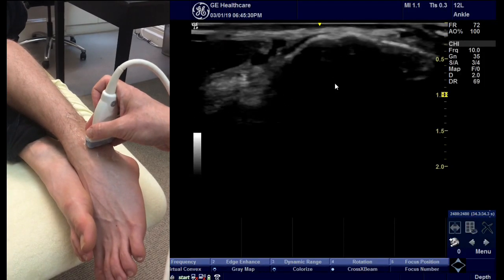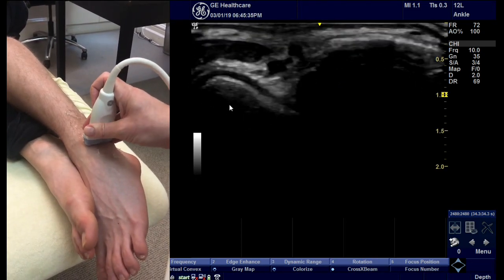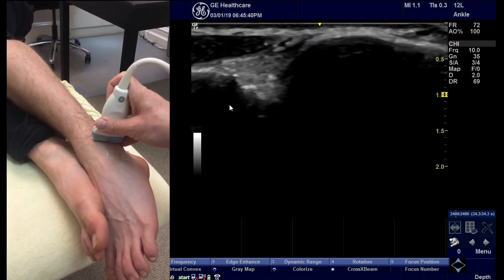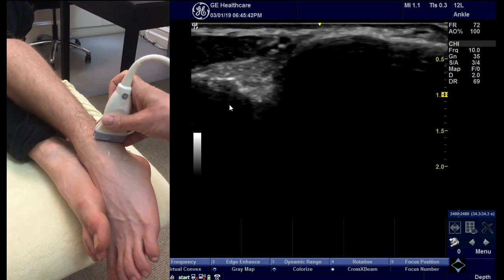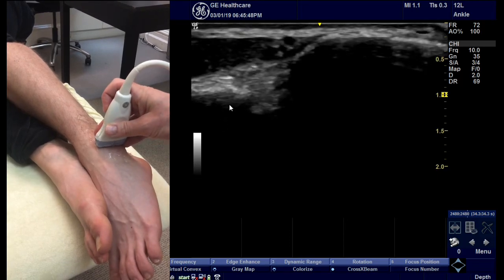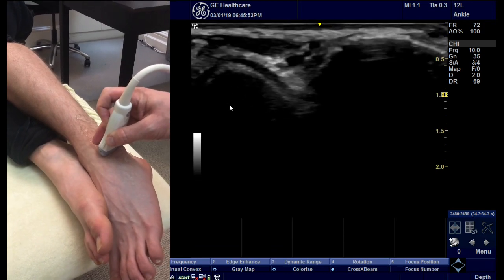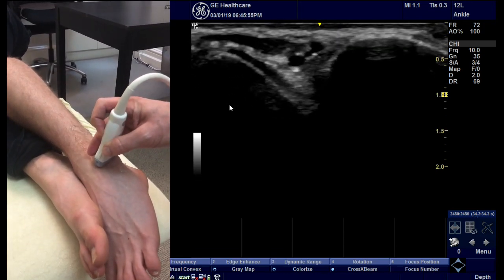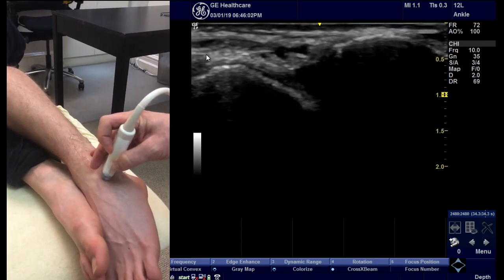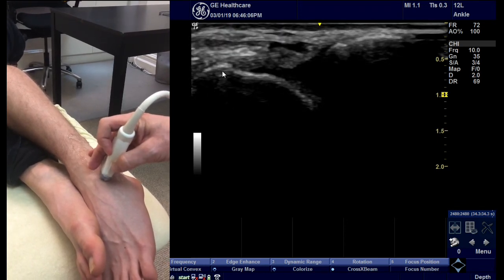I come down a bit further until the talus comes into view and the tibia has disappeared. This is the talus here. I angle up to the AITFL, which we've covered before, and then I keep the probe in that position with the lateral side of the probe over the fibula, and I roll the medial side round until the talus comes into view. Keep going round because the ligament doesn't attach where the cartilage goes over the corner, but you keep coming round until the cartilage disappears. This is the level where you expect to find the ATFL.